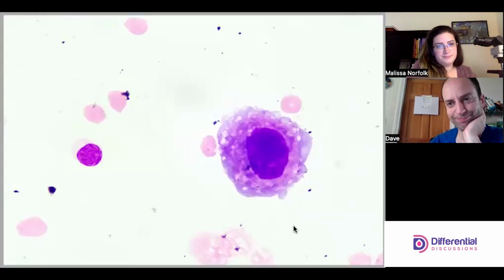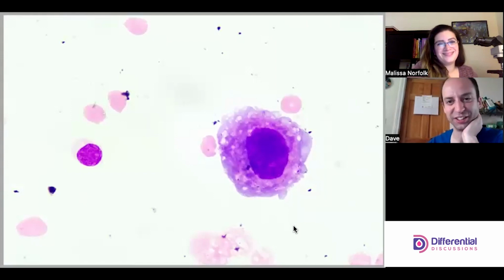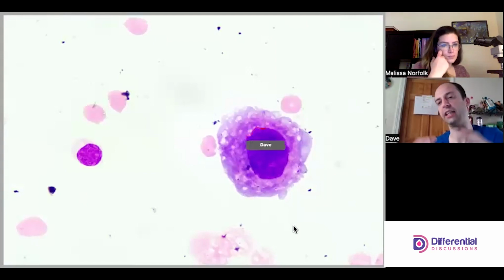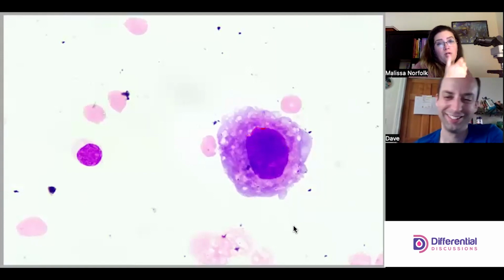So the dark staining is an abnormal finding of the cell, in case that point has landed clear enough. And then this weird nuclear contour. It's consistently just bad. I think looking at the chromatin pattern of the lymph will help emphasize what normal heterochromatin looks like.